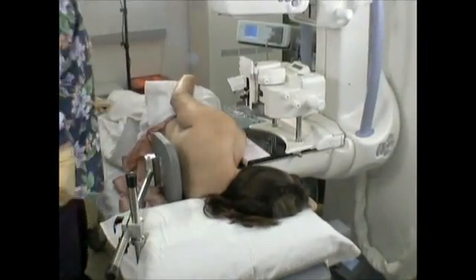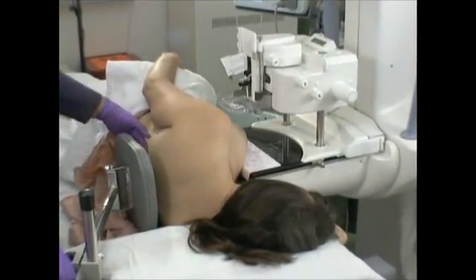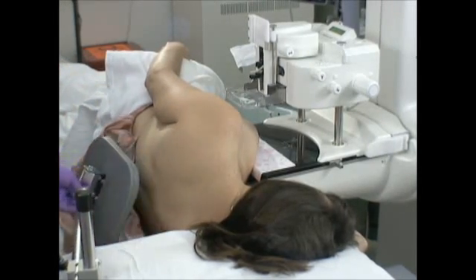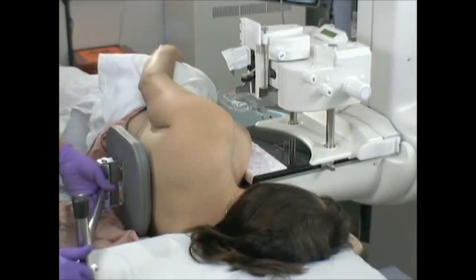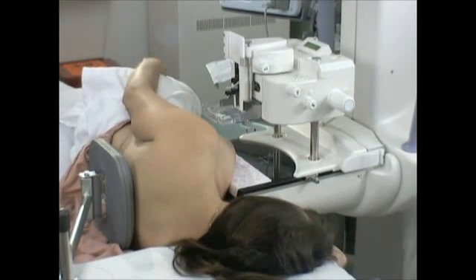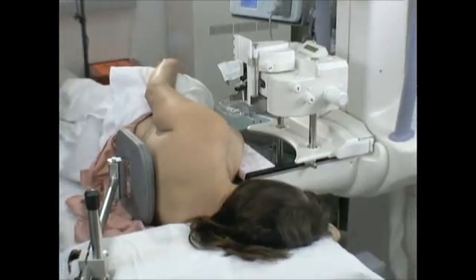We will place the patient in the lateral decubitus position with the left side up. With the Medical Positioning's DBI table, the patient is able to lay comfortably on her side. The table snugs up to the mammogram machine and we're able to offer the patient back support so that she's extremely comfortable. This is compared to prone positioning on a dedicated table, which is not nearly as comfortable for the patient.